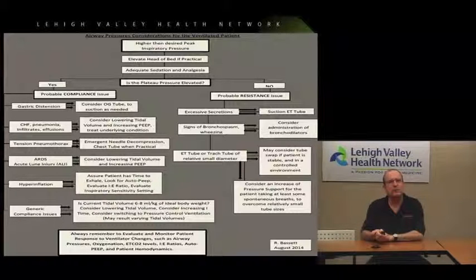Just a little bit of information on plateau pressures. On the 1200 you actually have to manually get it, and that's something you'll have to learn on the machine by doing an inspiratory hold, and then the machine will give you the reading. On the Hamilton T1, you can just go to the third diagnostic screen, and it'll give you a constant plateau pressure. Essentially, in the very simplest form, a plateau pressure is the pressure at the alveoli when there's no air movement. So that's the pressure that's actually at the alveoli, but the machine needs to measure it when there's not much movement going on.